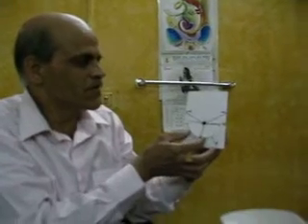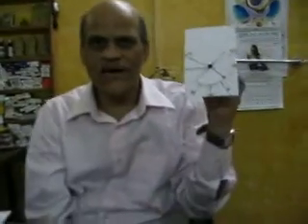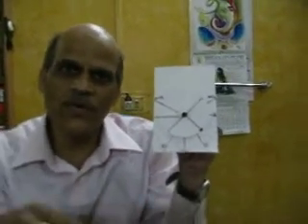So now what we do with our axis finder here is that we cover with this semicircle lead 1, 2, 3 and AVL, and here what it shows is this arrow here, it shows the direction of the axis of the frontal plane QRS. So this device is a very simple one, and whatever leads in your ECG are positive, you just keep covering them with this semicircle.